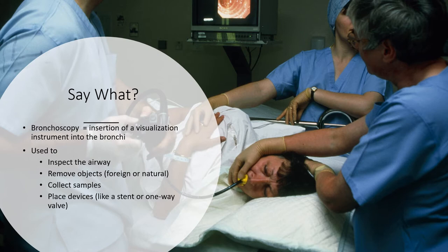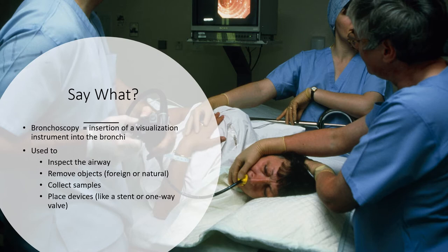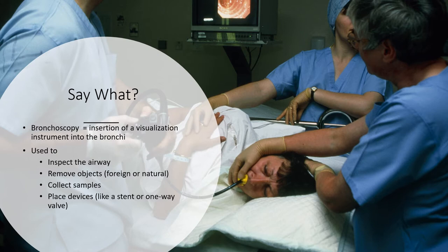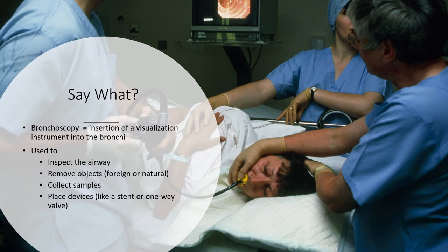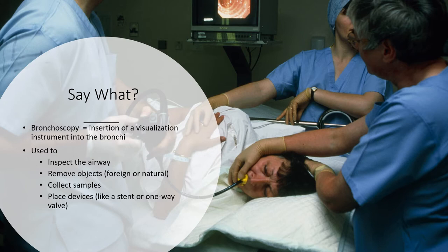One of the things we're looking at is using bronchoscopy to inspect the airway. When we did organ donations with Donor Alliance, we would do a bronch to look at the airways directly — not with an x-ray, not with a CT scan — but directly to see how healthy that tissue was. X-rays can lag behind on disease pathology, so we're looking to see if the lung tissue is healthy, viable, and whether lungs should be transplanted.